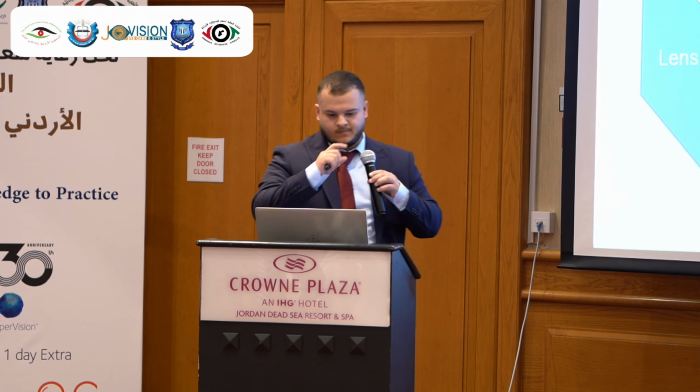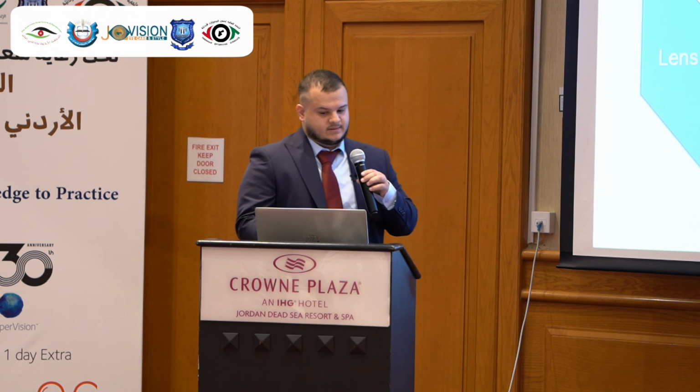Measurements are also taken. As we mentioned, watch for warning signs and maintain proper hygiene, cleaning the lens properly when storing and using it, and washing hands well before handling the lens. We also advise going outside daily and looking at long distances for 1 to 2 hours.